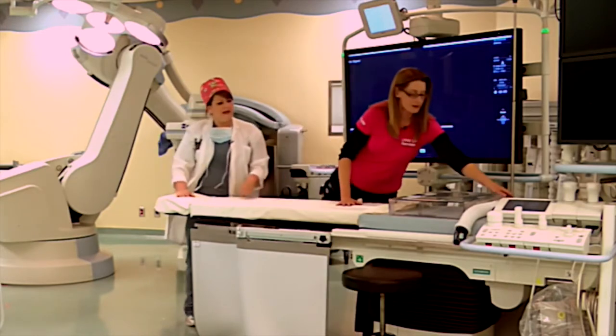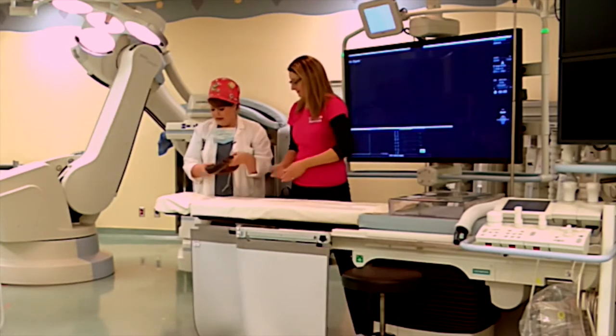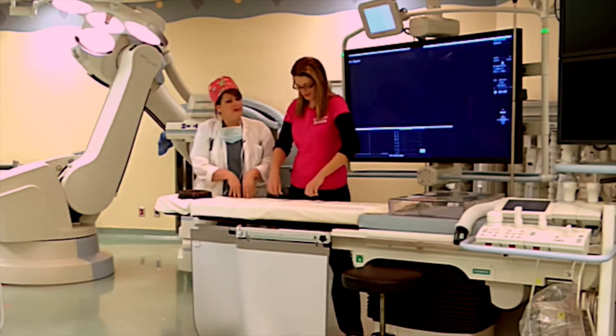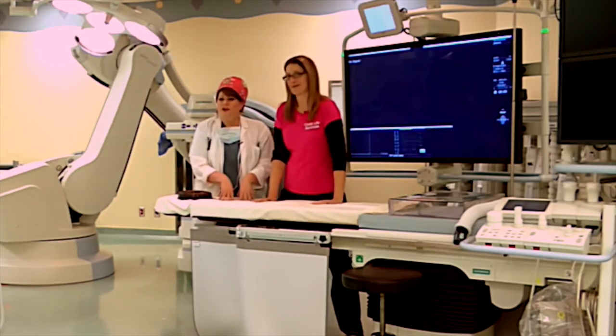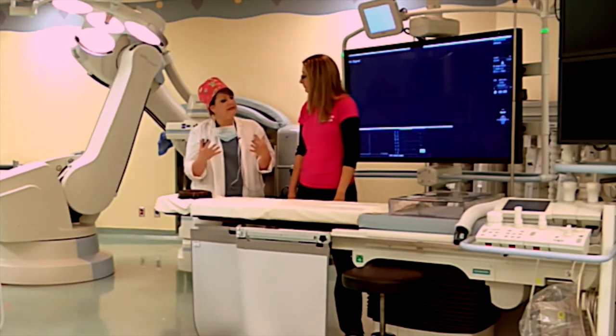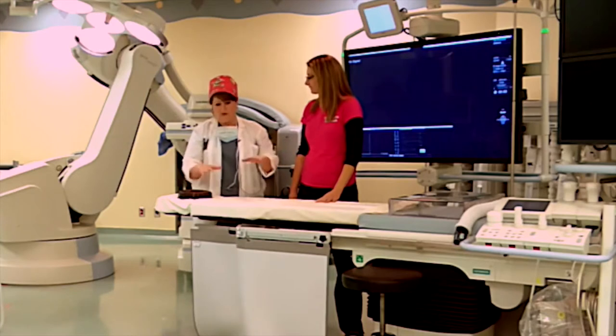I think I see that. Yes, my little gooey pillow. Whoa. You can sleep on that. Looks like a donut. Yep, it looks like a cake. And if you feel this mattress, it's actually a memory foam mattress as well. So you want to make sure you're very comfortable before we start. And if you're getting a pick line, tell us if something's uncomfortable. I want you to be in the best state before we even begin the procedure.